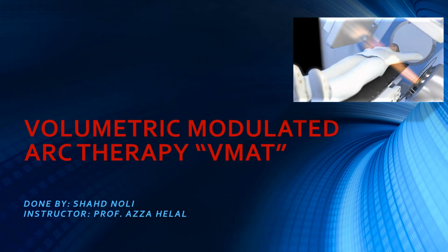Bismillahir Rahmanir Rahim. My name is Shahd Noli, and today my presentation is about an innovative and advanced radiation therapy technique called VMAT. VMAT is an abbreviation for Volumetric Modulated Arc Therapy, also known as Rapid Arc Therapy and Volumetric Arc IMRT. It is considered a fairly new technique because it was first introduced in 2007. It is a unique form of radiation therapy where the radiation is delivered in the form of an arc.